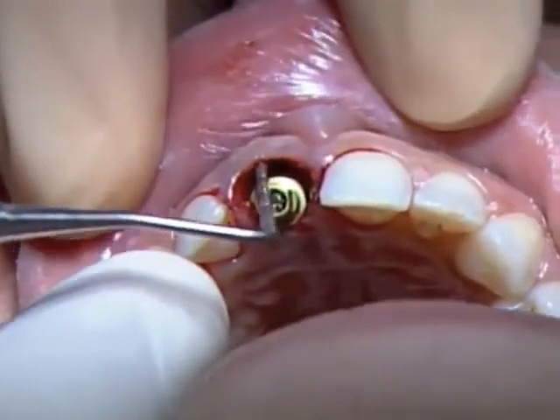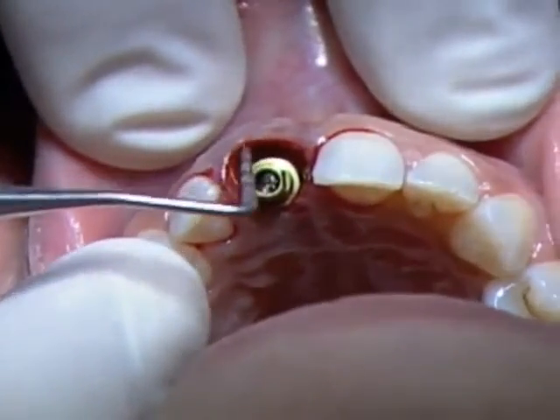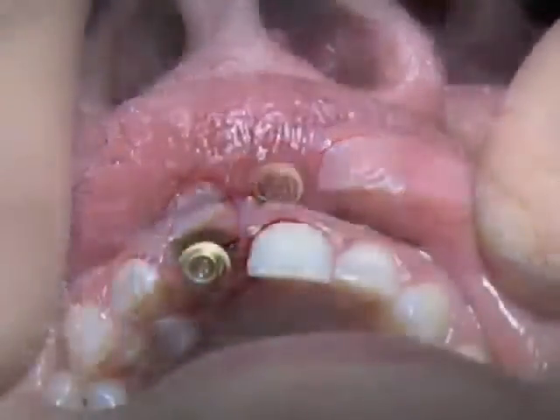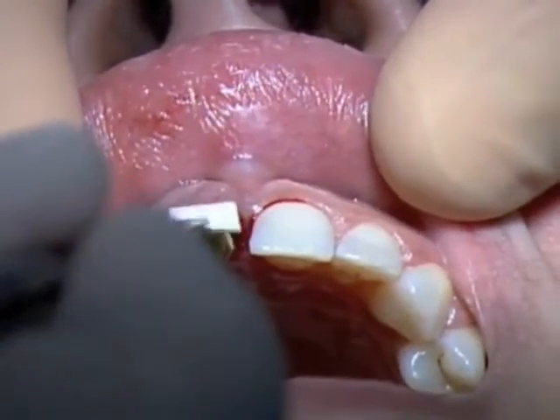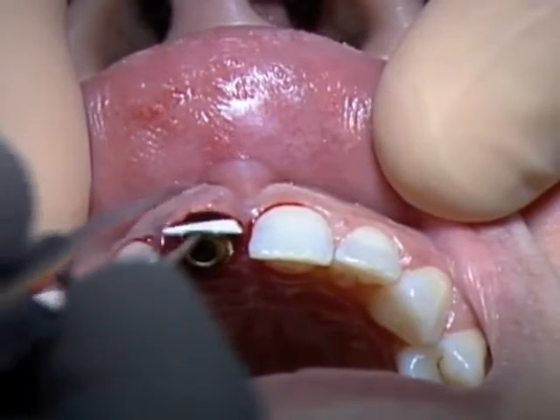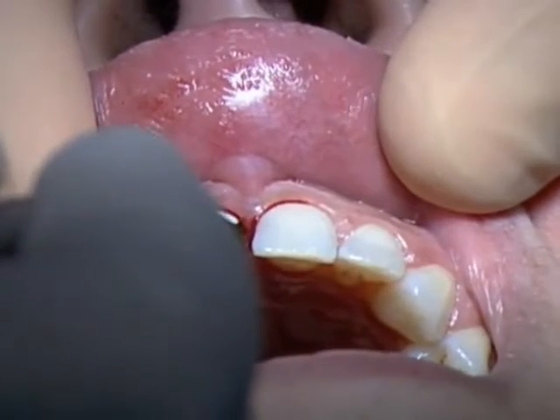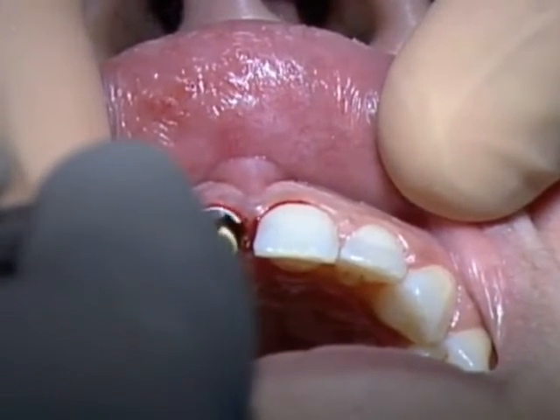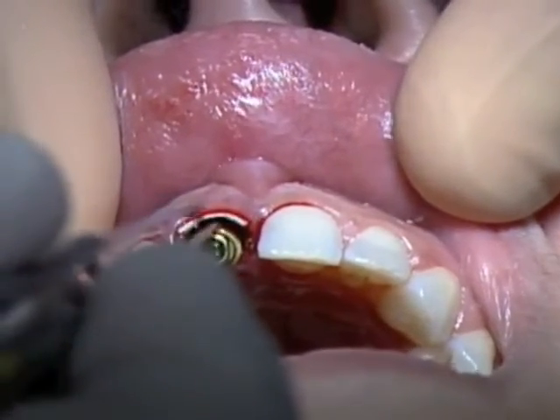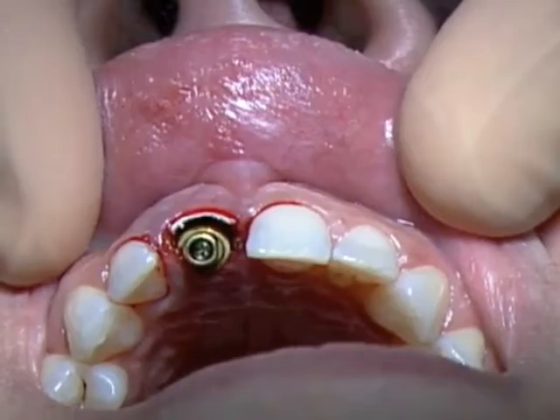Following that, we will control the height level of the buccal plate, and we notice here that we lack maybe 1 millimeter. So what we will do is we will place a collagen membrane and augment the area. Prior to that, we have already placed a 2 millimeter gingival height abutment. This abutment can also be used as a final abutment, so we can do one abutment one time. Of course, I prefer contoured abutments for this purpose, so in this case most probably we will change once.